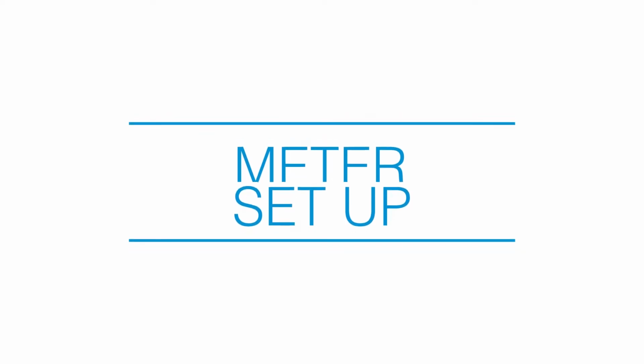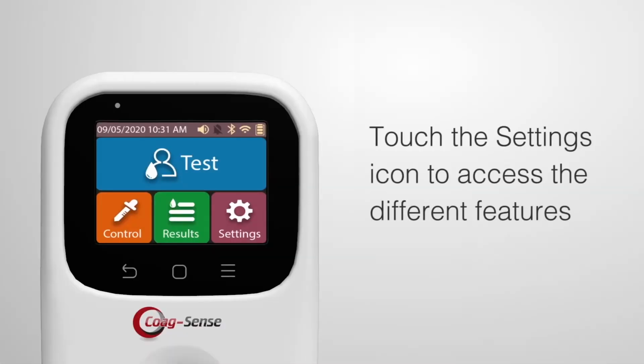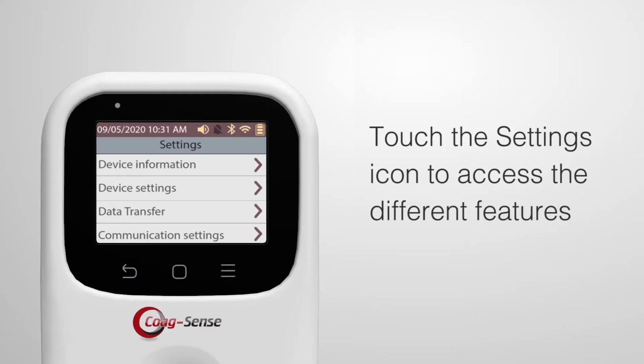Meter setup. Touch the settings icon to access the different features.